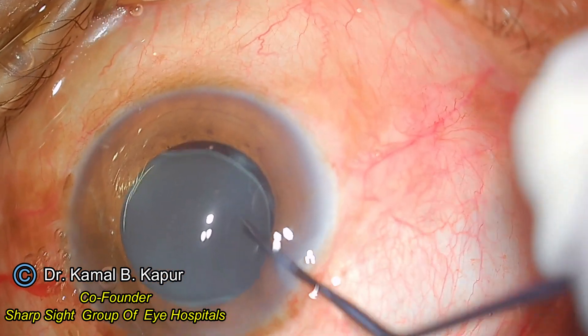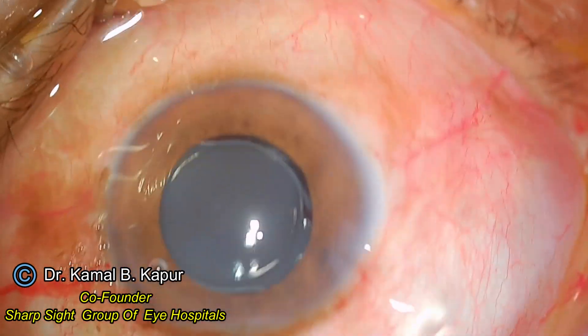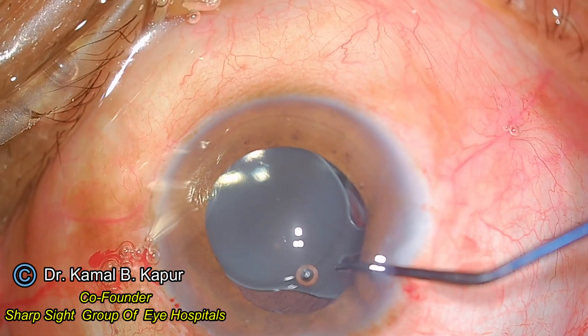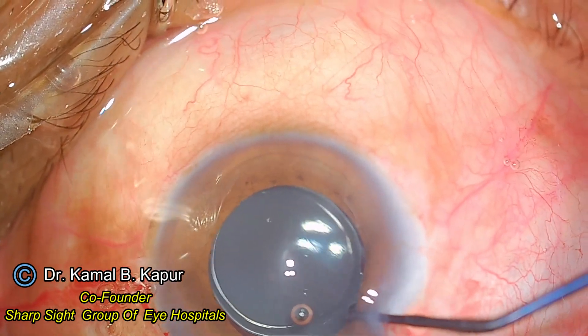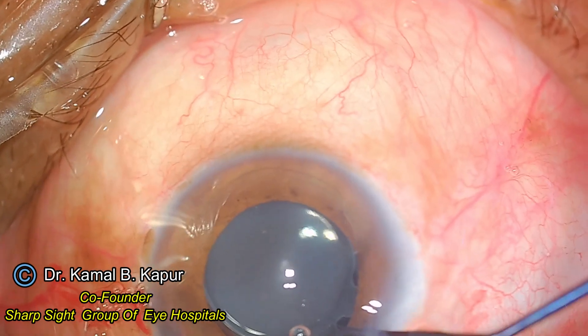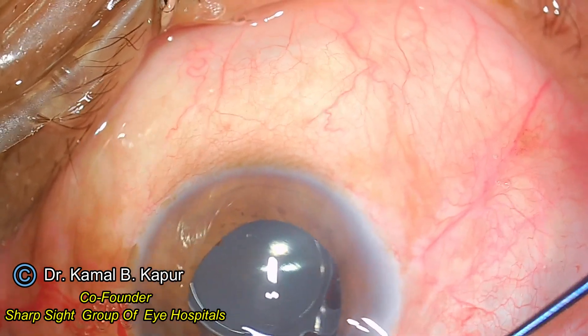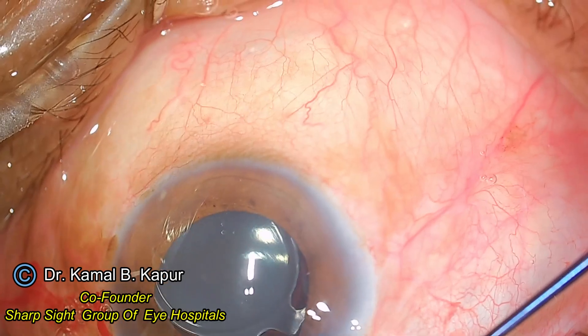However, I also notice that the other — the trailing haptic — is not moving at all. I try to get it out of the bag, but to my surprise I see that the haptic is able to come out approximately halfway, but the other half seems to be stuck to the capsular bag.